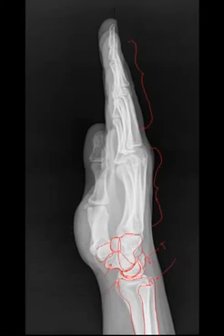Now the thumb, since it lays off to the side, we can identify those structures. This is the metacarpal. Here is the proximal phalanx and distal phalanx, but you're familiar with this anatomy now, so you know exactly what I'm pointing to. Here is the interphalangeal joint of the thumb and the metacarpophalangeal joint of the thumb. There is a little sesamoid bone. We saw it on the other projection. We also want to make sure that there are no ligamentous or tendinous calcifications or soft tissue calcifications within this region.